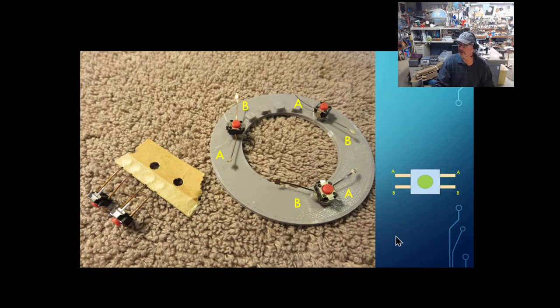And I've labeled on the ring here just kind of a guide to make things simple. If you're using this switch, just do the same thing with A and B. In fact, this switch might even be simpler because you've got two places in every switch to solder to. But either one of these will work just fine.